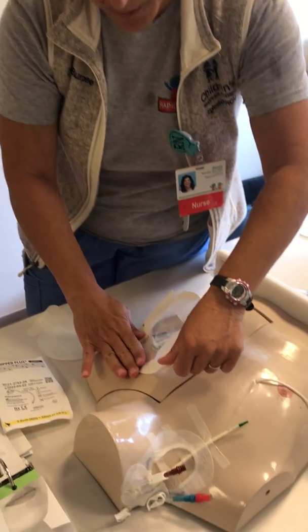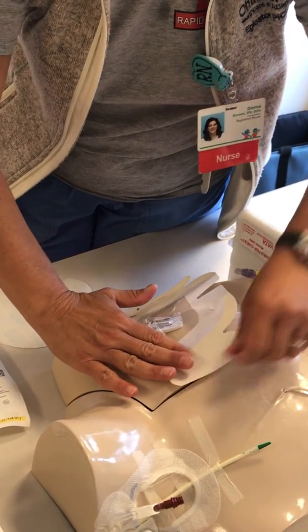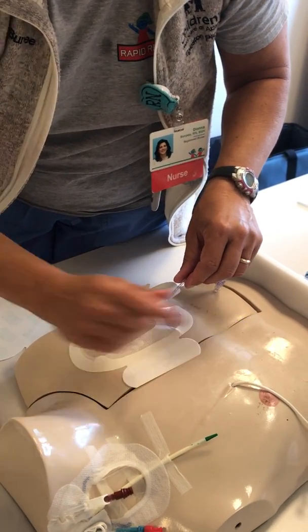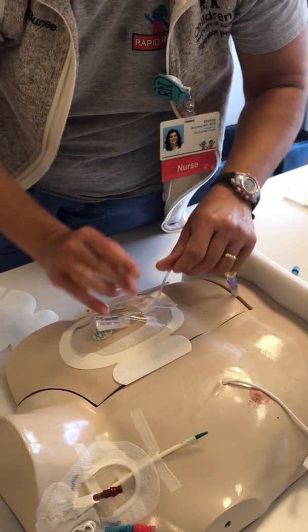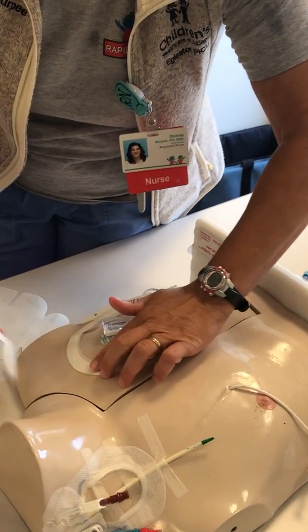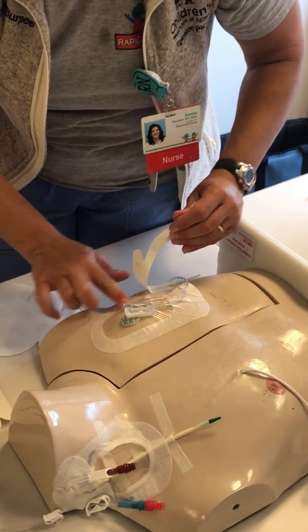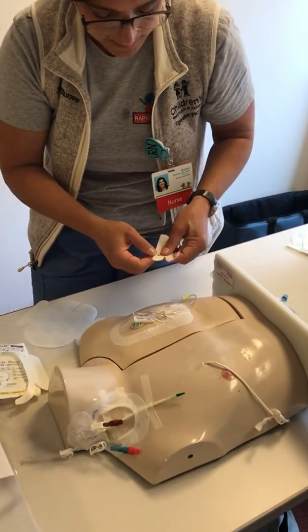So you'll put this larger Tegaderm on. And I never just put a dressing completely on. I usually start at one side and just go all the way around. And then have my other person hold up the line, and then cross these legs. It's like what we'd like to say. And then always make sure you kind of follow your path of when you're taking off this piece of paper here to make sure it stays down. That'll help after you've used your skin prep and all that stuff, but that'll help hold that down.